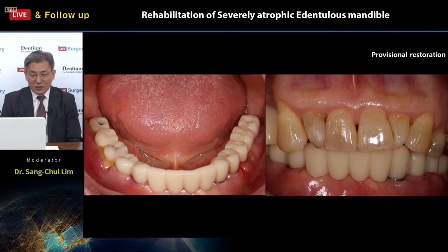How can it be achieved faster? First, proper positioning with a higher insertion torque. And number two, digital technology makes it clear to make the PMMA temporization with the custom abutment. After the full temporization period, like 6 weeks or 8 weeks, the soft tissues are healed and fully matured, and then the transformation to the final restoration with the zirconia with the custom abutment.